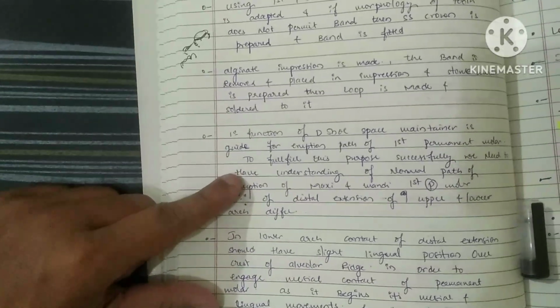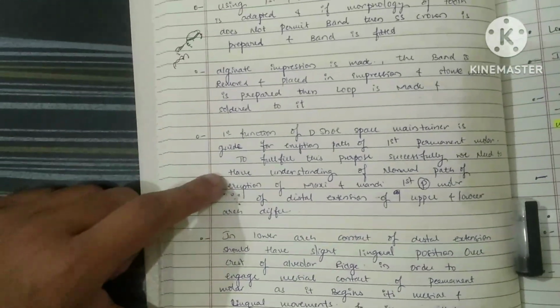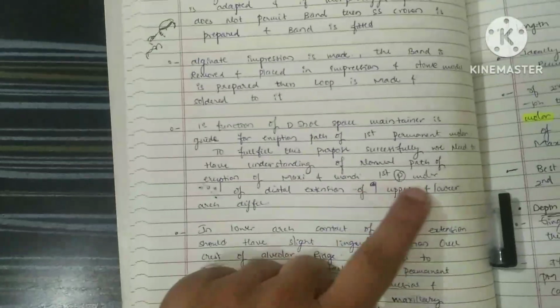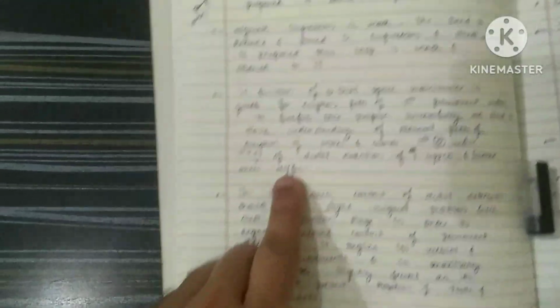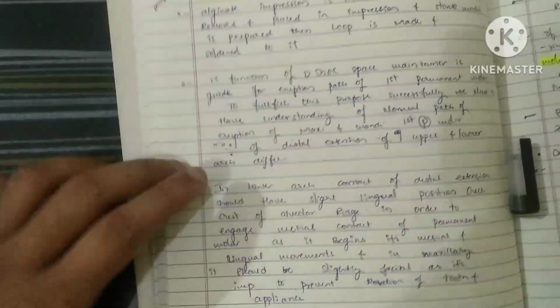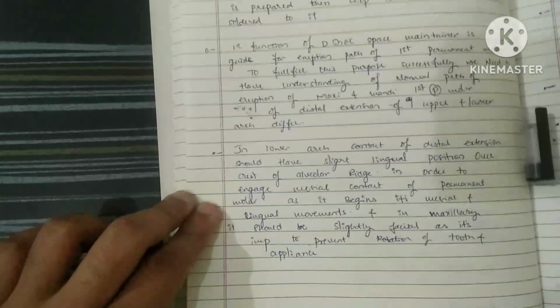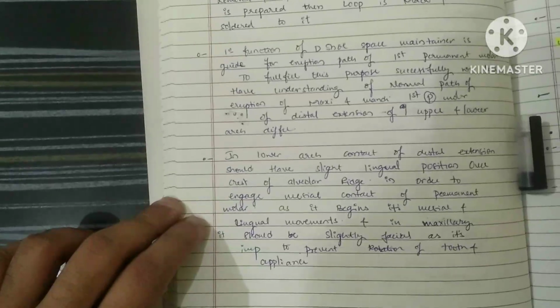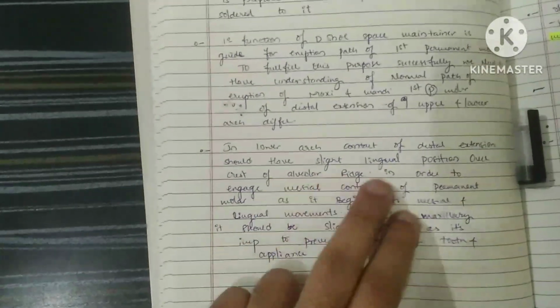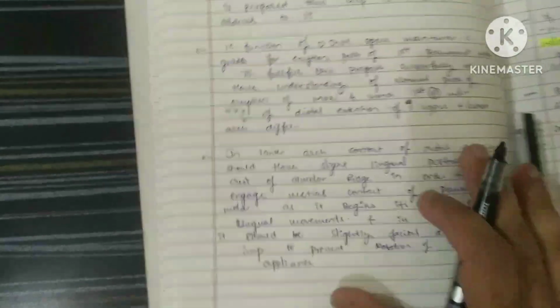To fulfill this purpose successfully, we need to understand the normal path of eruption of the maxillary first and mandibular first permanent molar, because the distal extension of the upper and lower arch differ. Okay, understood? Now here in the lower arch, the contact of the distal extension should have a slightly lingual portion over the crest of the alveolar ridge.